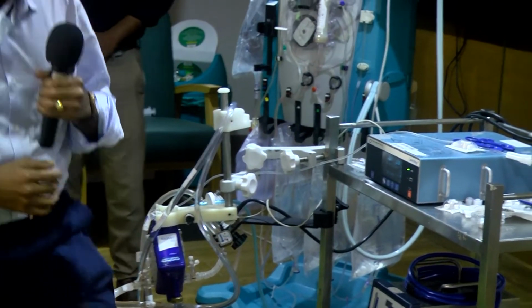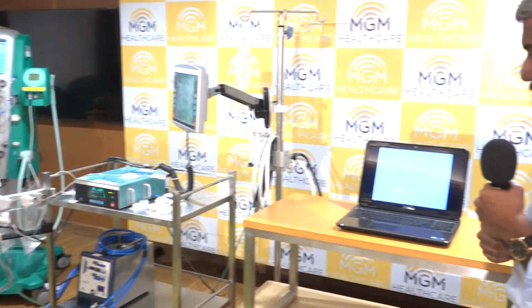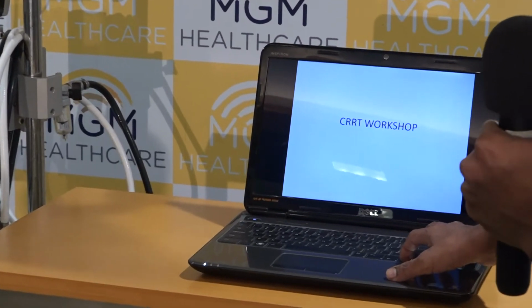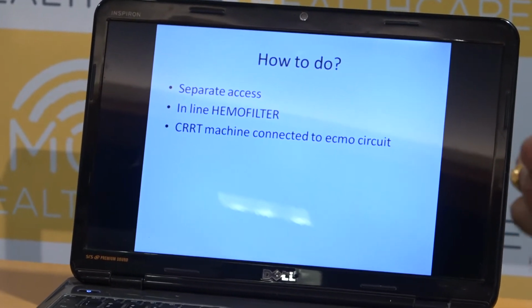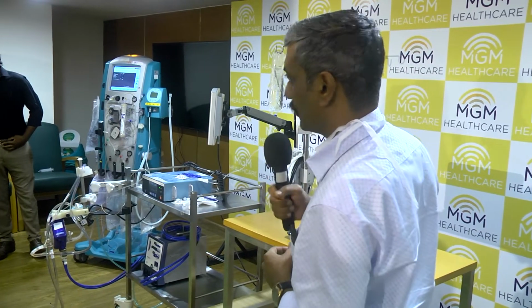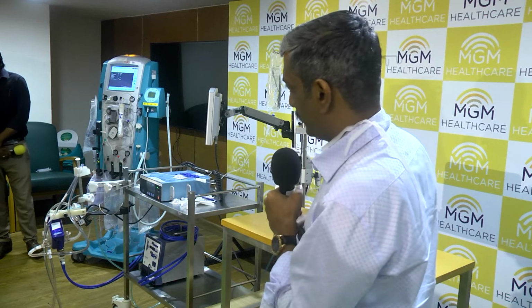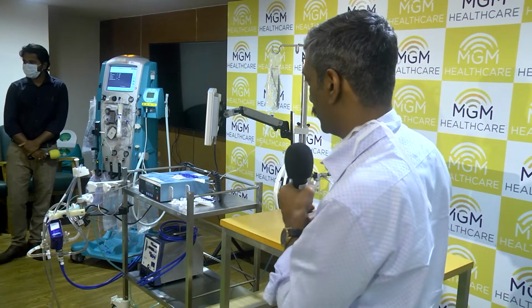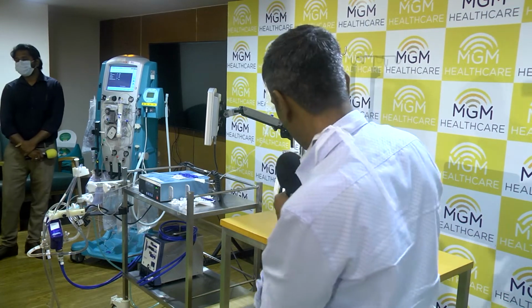So once you have decided to start giving renal replacement therapy for a patient on ECMO, what are all the options? The best one would be to put a separate access line and do CRRT in that always. So there are no disruptions, and your preferred dose is always continuously given. But in ECMO, your great vessels are being used. If you're in VV, both the veins are used and you have only one more vein. So to avoid that, you can connect the CRRT into the ECMO circuit.